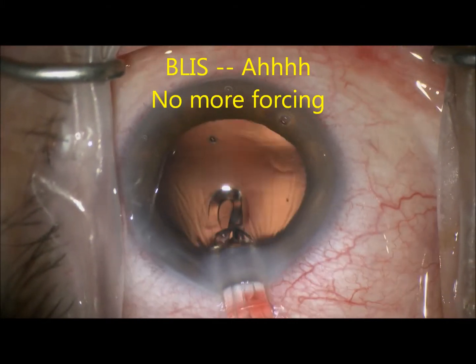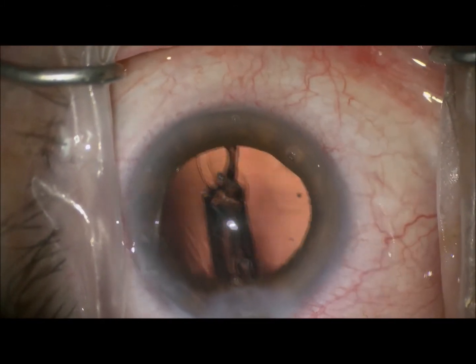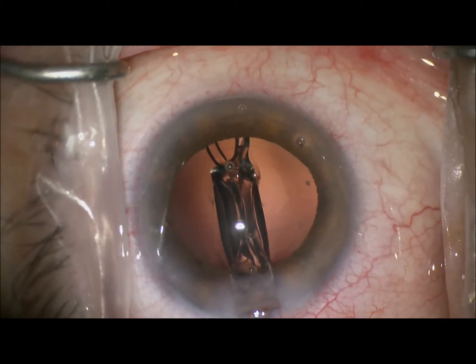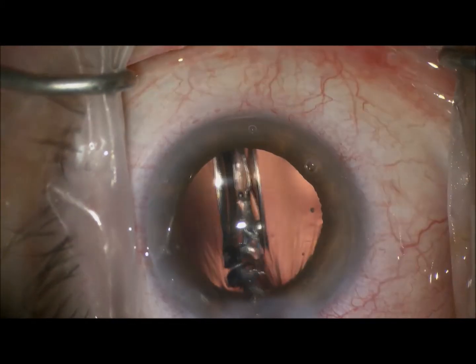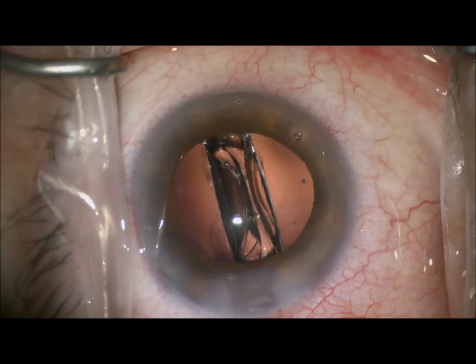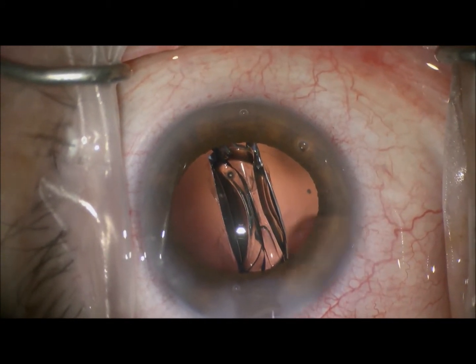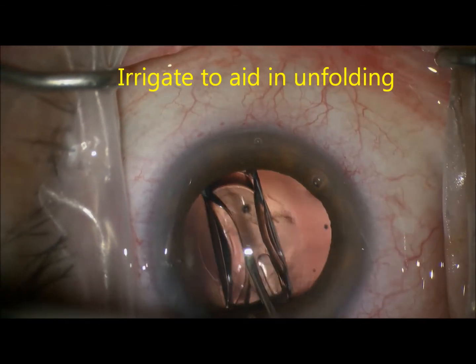We simply turn the screw inserter and inject the lens into the posterior chamber. Once there, we'll use a technique to first position the lens completely in the posterior chamber, and then we'll use some fluid injected within the lens to aid in its unfolding.